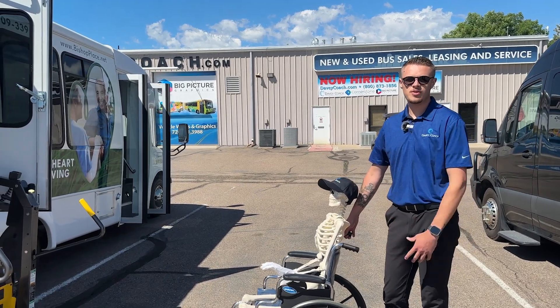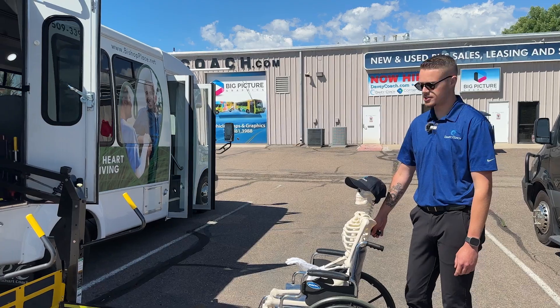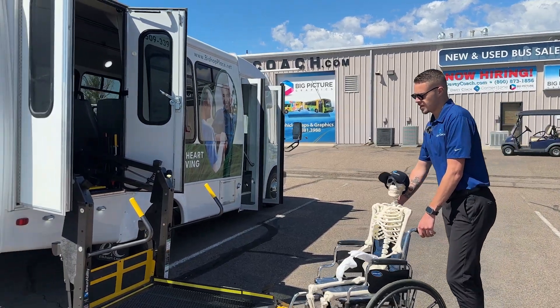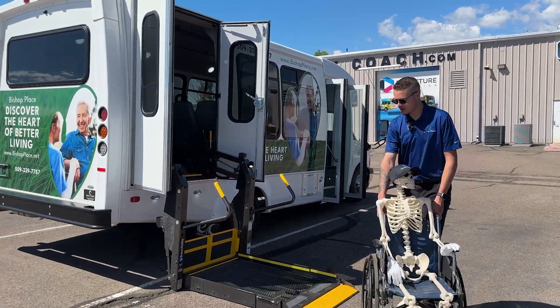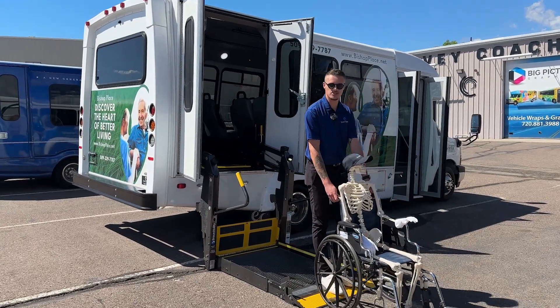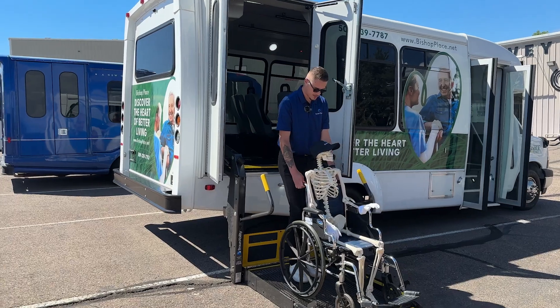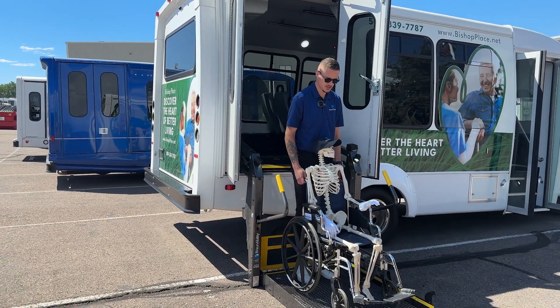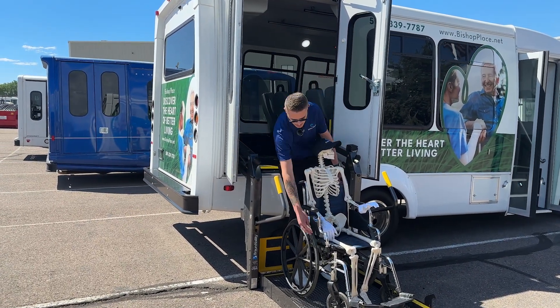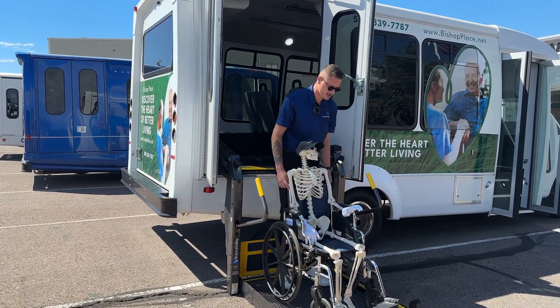We are going to load Davey Bones into the vehicle and properly secure him with the wheelchair securements. To load him, if you're going to stand on the platform with him you want to load him reverse, otherwise you could load him on by himself. So we'll load him up here. Once we get him centered on the platform, we're going to make sure our parking brakes are applied to both sides of the wheelchair lift.